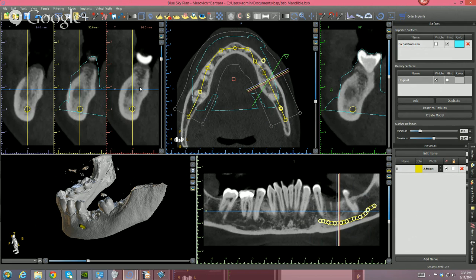Now, there are cowboys out there who want to be a quarter of a millimeter away. You know, I love horses from a distance. You know, this is a patient. So 2 millimeters is a good number. That means that there'll be a lot of cases that you have to say no to. But you know, that's important.